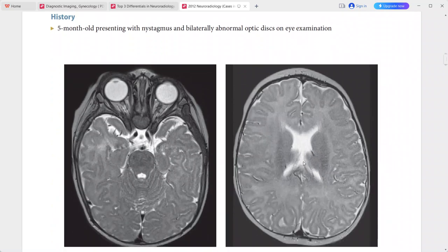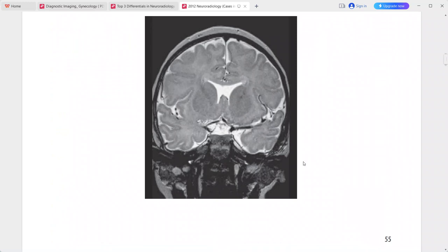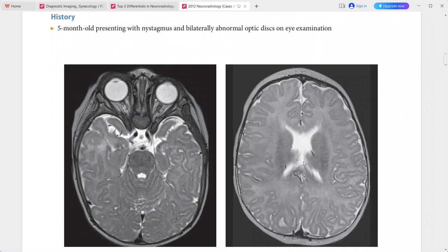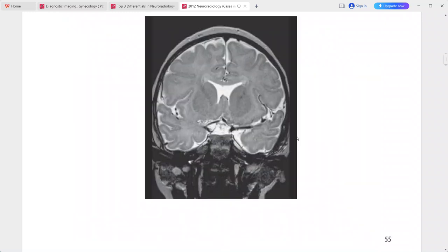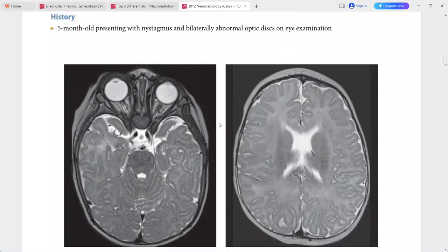Next case: 5-month-old with nystagmus and bilaterally abnormal optic discs on eye examination. T2-weighted MRI shows abnormally small bilateral optic nerves, a small optic chiasm, and absence of the septum pellucidum. The diagnosis is septo-optic dysplasia.